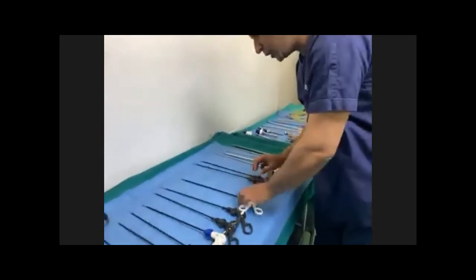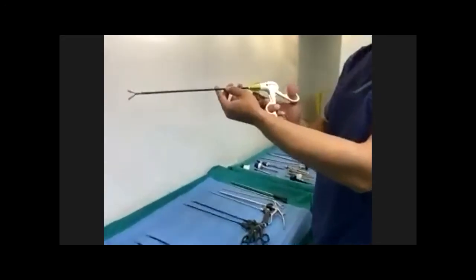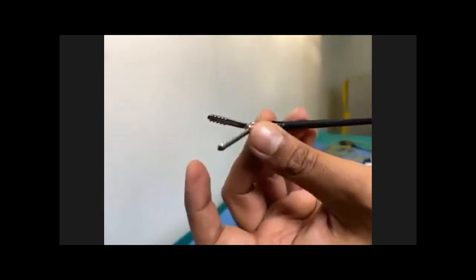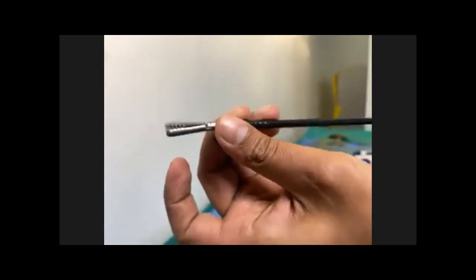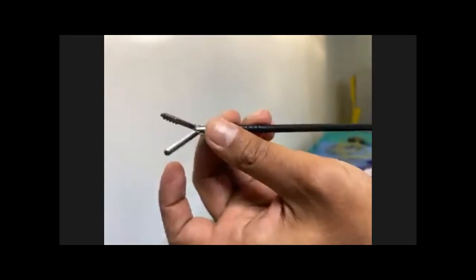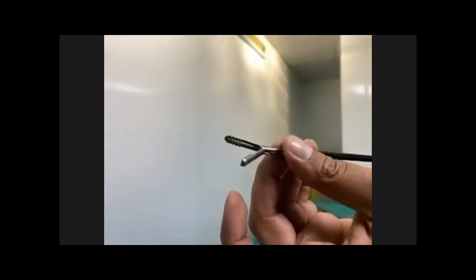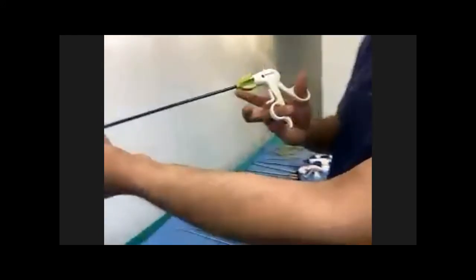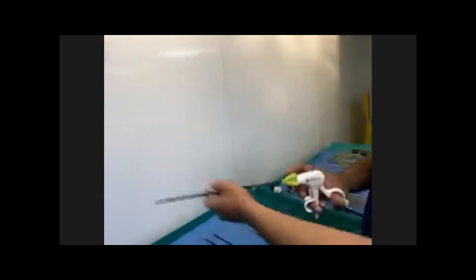Now I will show you a disposable instrument with a lock. Here you can see there is a lock. It is a grasper which has ridges, and it will be able to hold the viscera well. Like in laparoscopic cholecystectomy, sometimes you need a grasper if it is so inflamed or there is empyema that you should hold it well. And it has a lock as well. If it is locked, you can see it cannot be opened until and unless you unlock it, right?